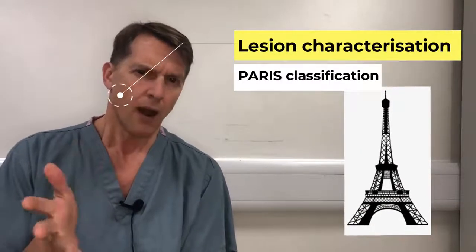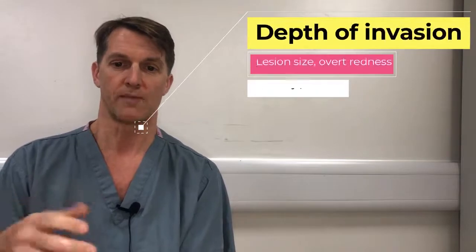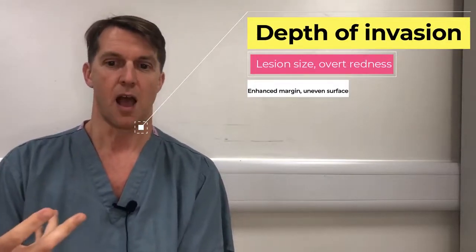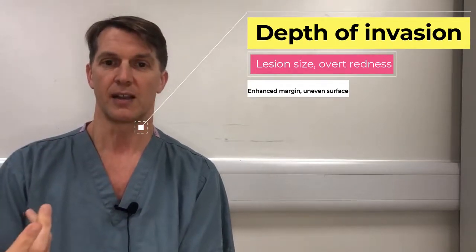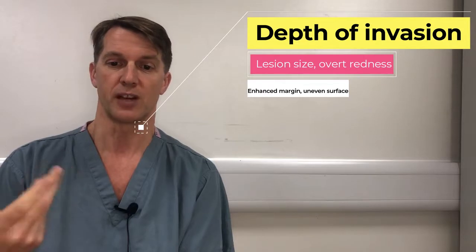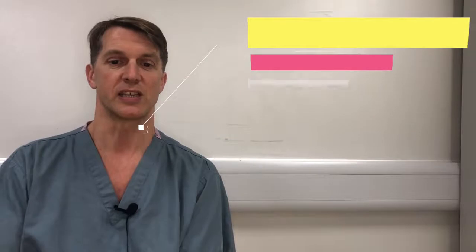Now, there are a few papers looking at how we can accurately try and assess the depth of invasion to assess whether or not this can be resected curatively. And again, we use features such as the size of the lesion, over 30 millimeters being a poor prognostic feature, overt redness, enhanced margins. So if the margins are very raised, then the likelihood of deep invasion increases. And finally, if the surface is particularly uneven, that suggests there may be more depth of invasion.